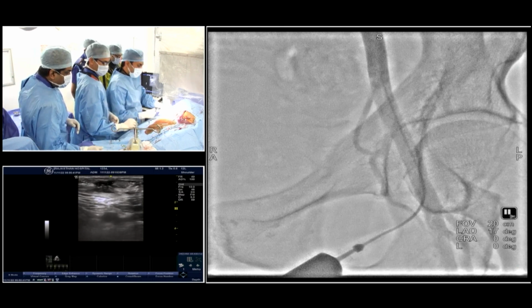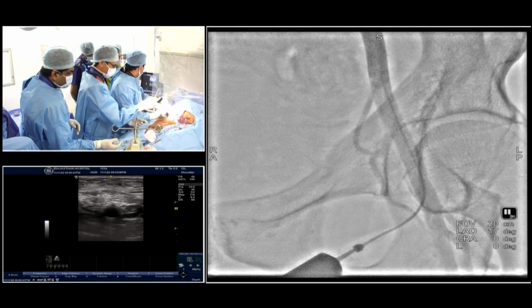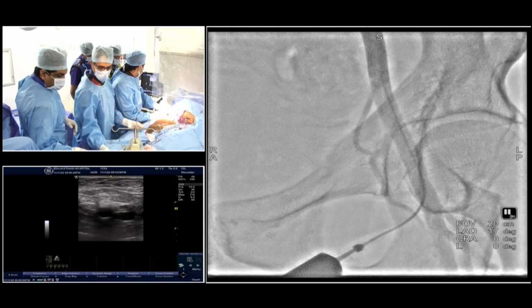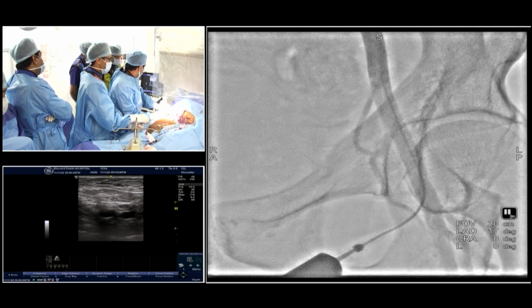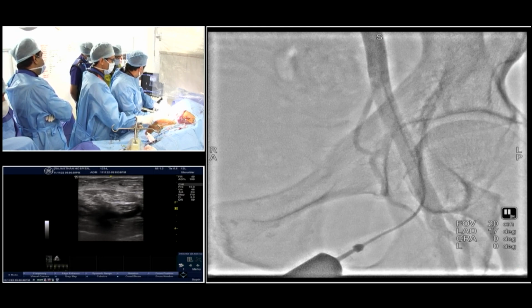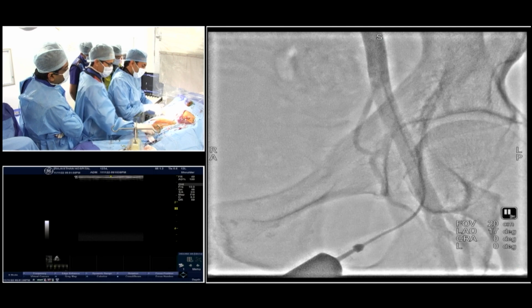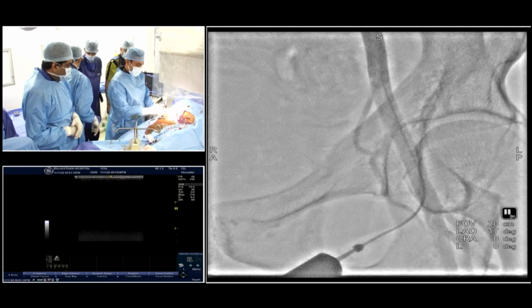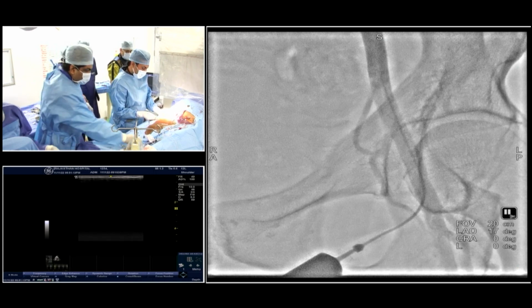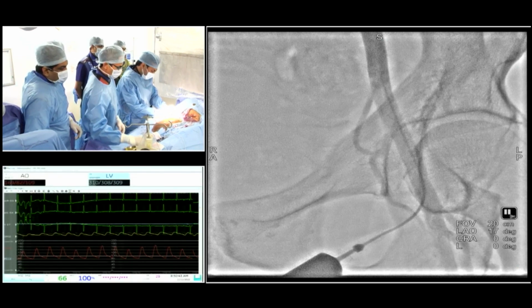So in my practice, all larger annulus get a balloon expandable valve. That is for sure, because it's very difficult to control a larger self-expandable valve. Everybody has done those larger self-expandable valves also, but the data clearly shows that a larger self-expandable valve is associated with more pacemaker rate and no real hemodynamic advantage compared to a balloon expandable valve. A very small annulus, I would choose a self-expandable valve. Regarding the implant depth, in the majority of our cases, we would just like to stay within 3 mm below the annulus.